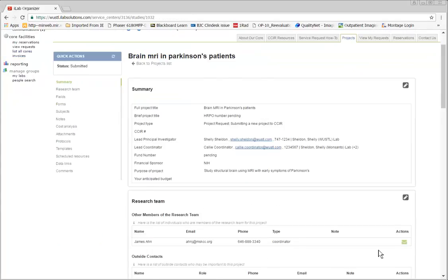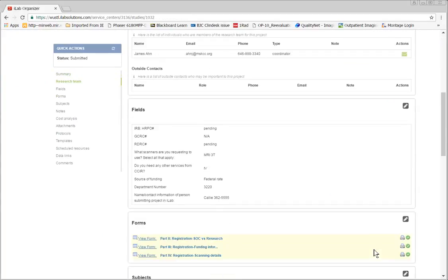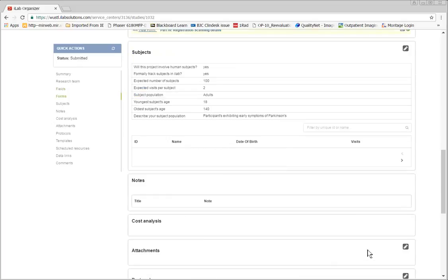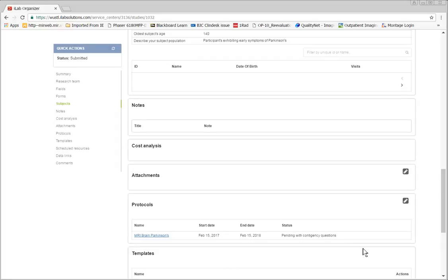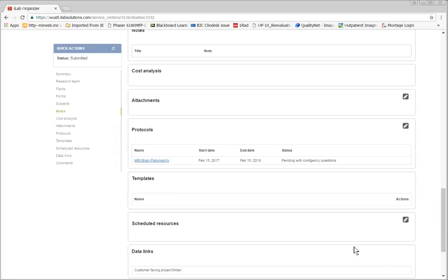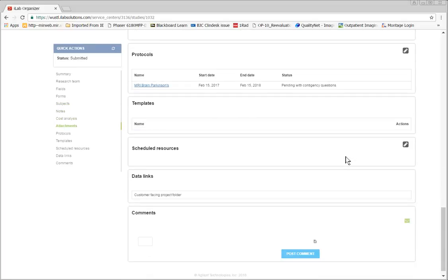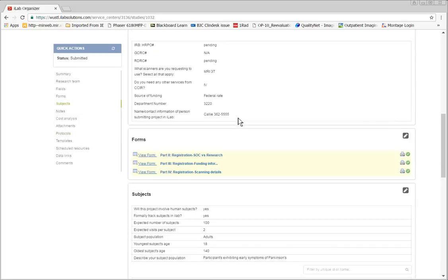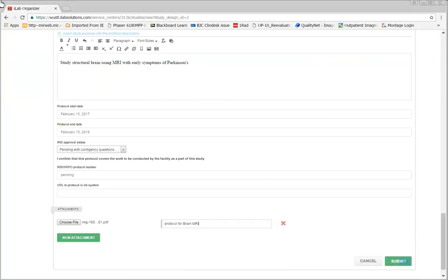You can review what you've entered for your project request by clicking on the summary items to the left of the screen. When you are satisfied with what you've entered, be sure to hit the green submit button at the bottom of the screen.